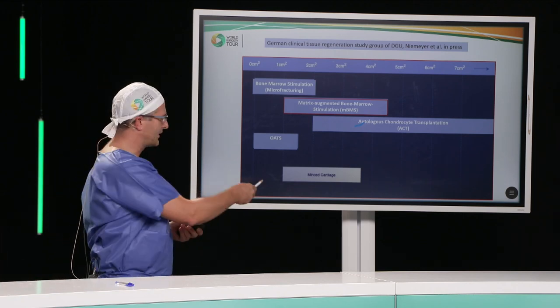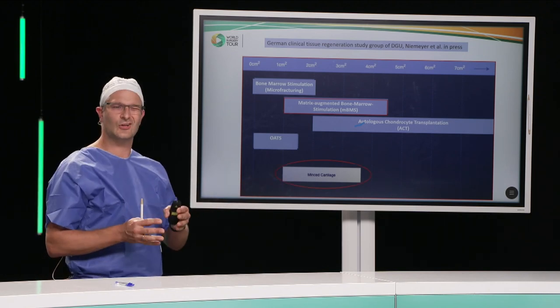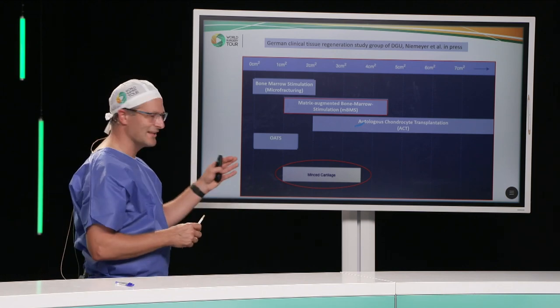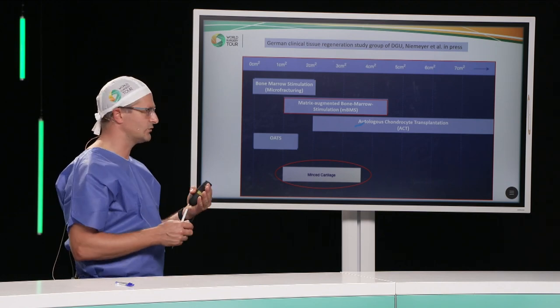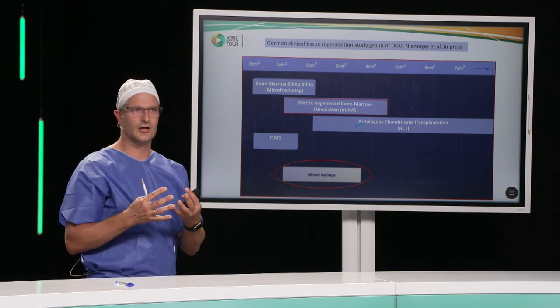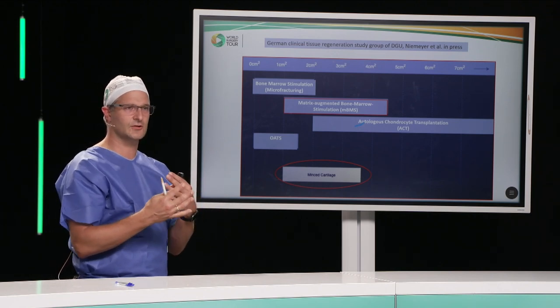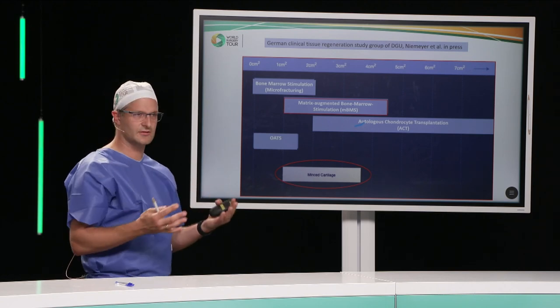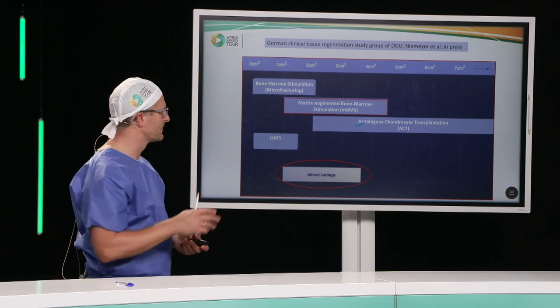But you can also see already, as has been mentioned, that there is a new technique emerging, which is called minced cartilage. It's not really new. Imhoff actually looked at it many years ago, but now it has really picked up momentum. So the idea is that you can collect cartilage from the area of the defect. It has been proven that a lot of these cells, the chondrocytes, are still metabolically active, and they can be collected and then applied in a single-stage procedure.